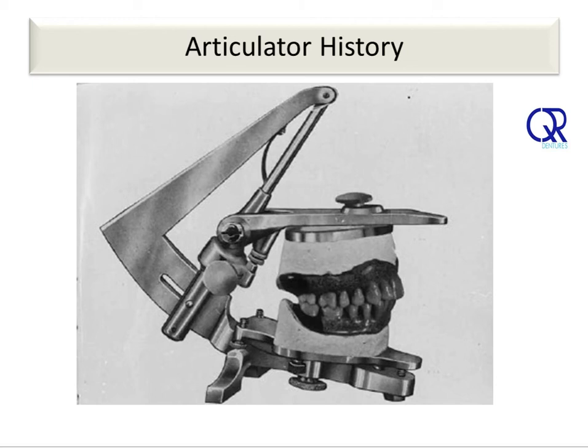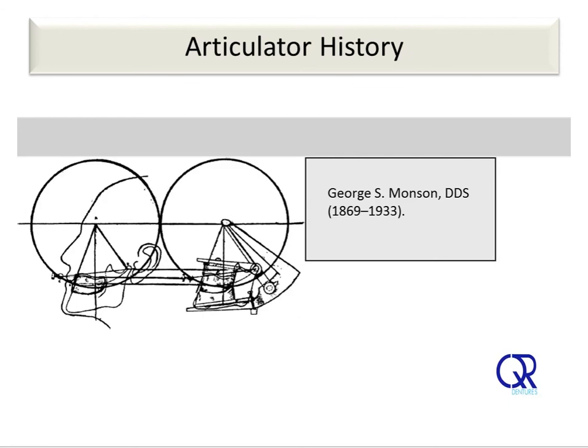In his own articulator design, he clearly manifests his own thought process by giving his articulator the visible centre of rotation, which in turn allows his spherical theory to describe the movement of the human stomatognathic system.